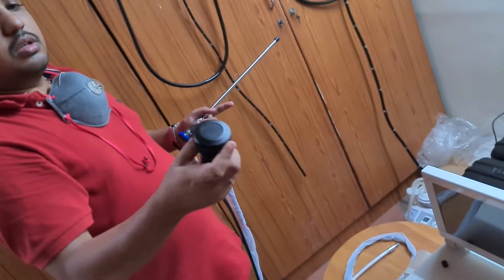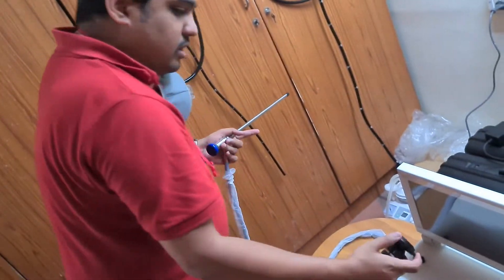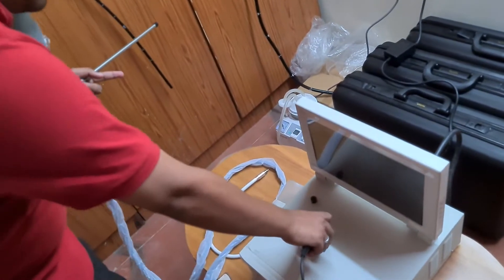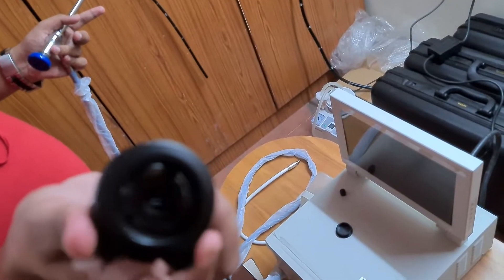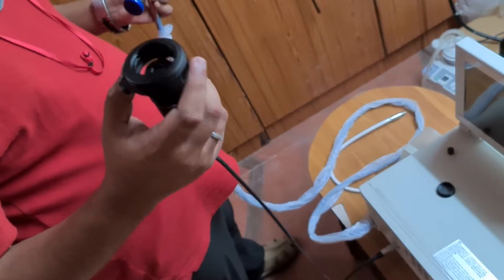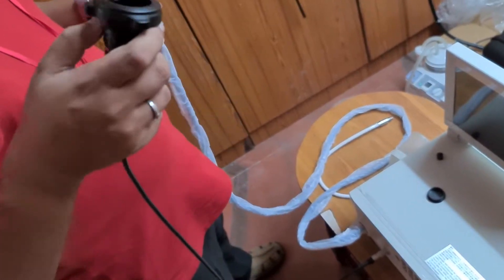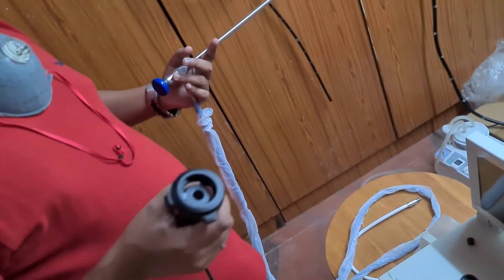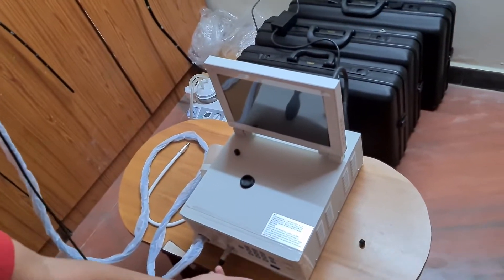Next, remove the camera head protective case — you need to press both hinges together so that the camera head is now open. First, before connecting to the scope, let me switch on and show you the clarity, and then we will connect it to our scope and check the image quality. I am going to switch on the processor.